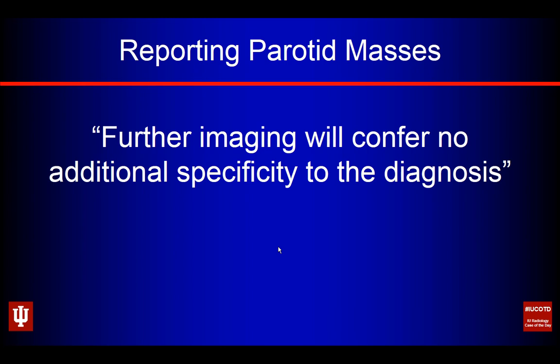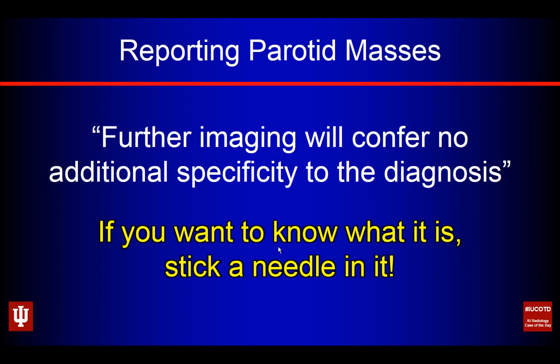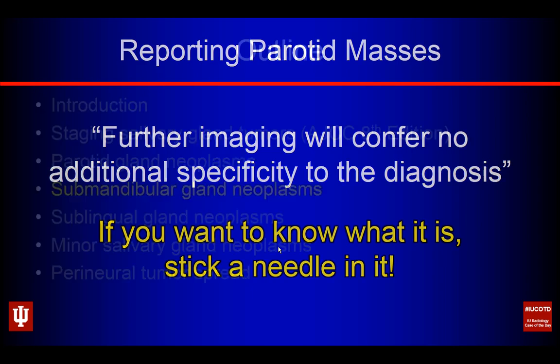But at that point, I put in my reports, further imaging will confer no additional specificity to the diagnosis, and then recommend a biopsy. If you want to know what it is, you're going to have to put a needle into it. And as a radiologist, that's something that you can do, whether it's through ultrasound or CT. This is in your wheelhouse. This is something that you can do to provide a clinical service to your ENT and oncology colleagues.